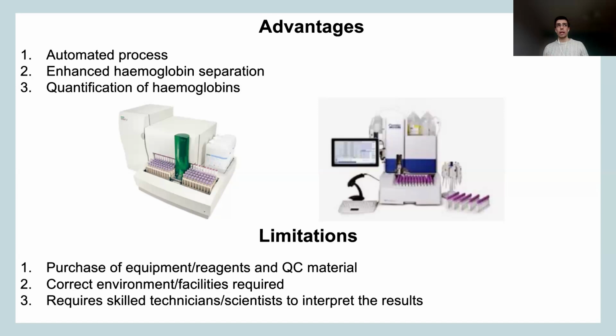It's not just having the analyzer, you also need to put it in a place where it actually is going to work properly. The HPLC is temperature sensitive. Although there are ways that the manufacturer tried to go around to make it less temperature labile, it is very important that it has nice facilities with a controlled temperature. Otherwise, the chromatography is going to run faster or slower depending on the temperature you're having.